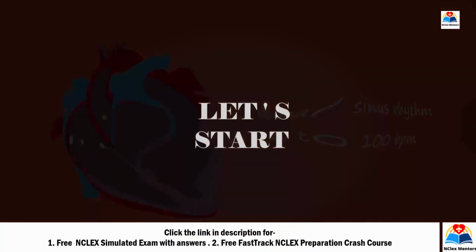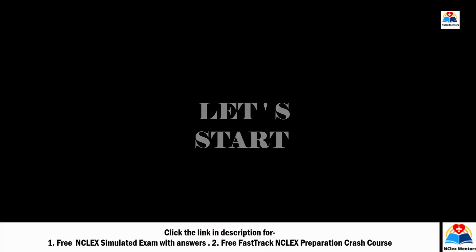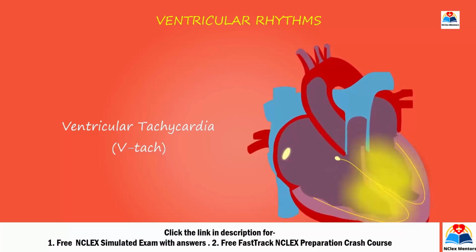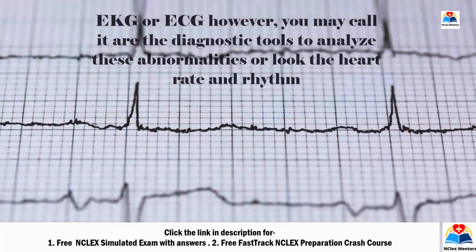Without much delay, let's start on today's topic. As a registered nurse, we should be able to read and analyze the heart rhythm and cardiac abnormalities, which could be heart block, cardiomyopathy, pericarditis, or any heart diseases. For this purpose, we need some diagnostic tools. So, EKG or ECG, however you may call it, are the diagnostic tools to analyze these abnormalities, to look at and interpret the heart rate and rhythm. Note that EKG or ECG, which are used interchangeably, are also called electrocardiograms.